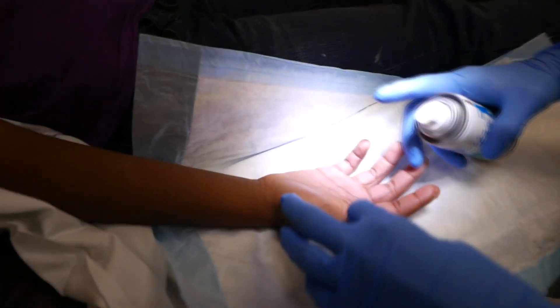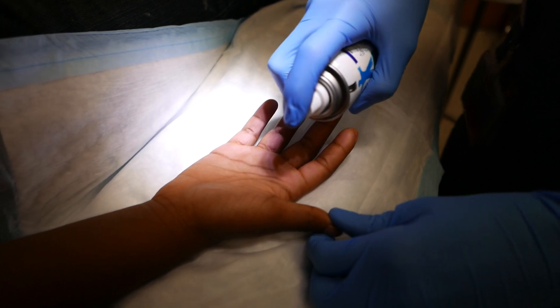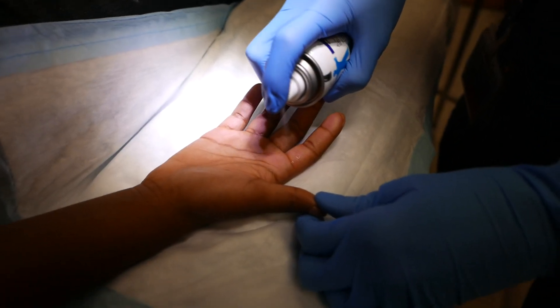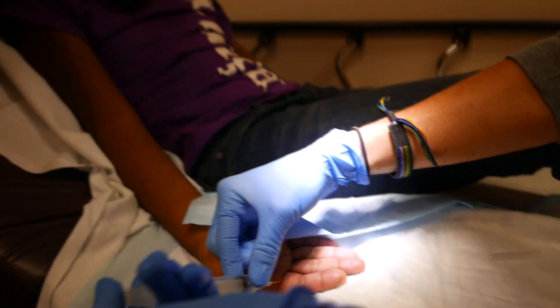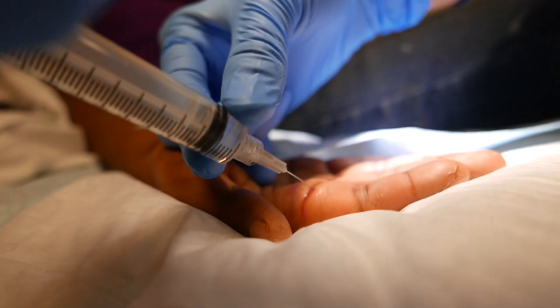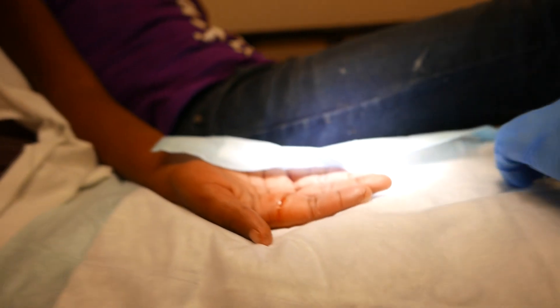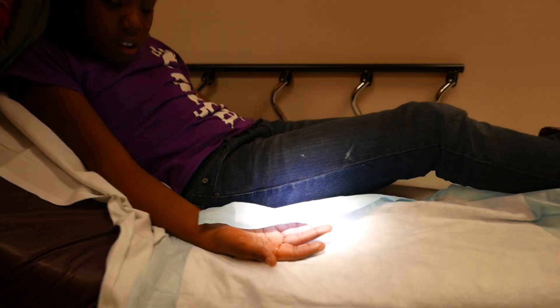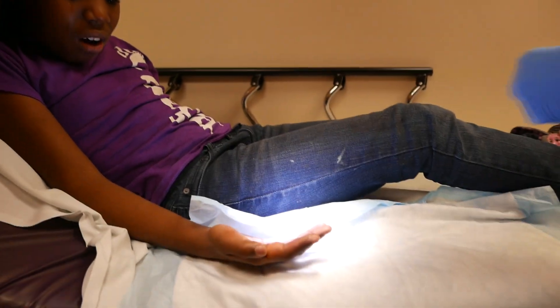All right, you ready? So just spread these ones out. Okay, so we're gonna go for 10 seconds, okay? One, two, three. You all right, hun? I'm putting a lot in there to make sure you're numb, okay? You did great. You did fabulous. All right, start moving that finger around — we want to get that all numb.